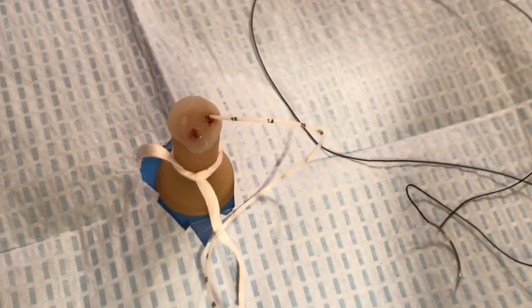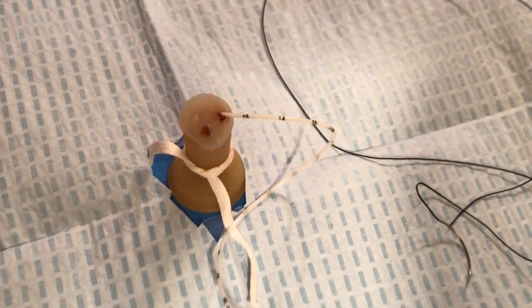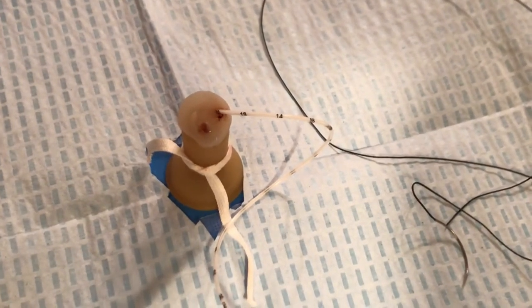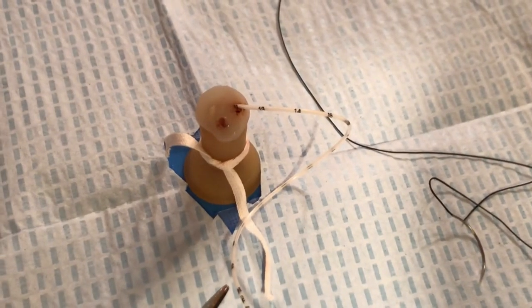This video will demonstrate the suturing of an umbilical venous catheter. We will identify the two arteries and the one vein in the umbilical cord. Care should be taken to avoid piercing or suturing the arterial vessels in the cord.